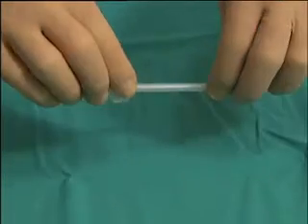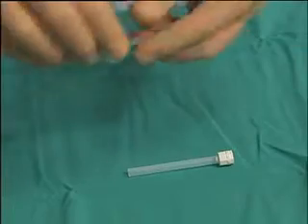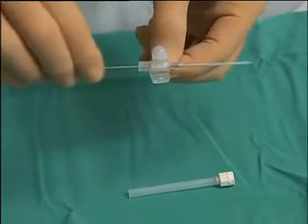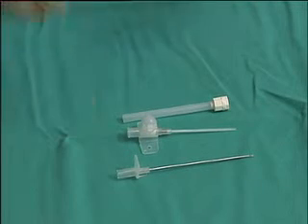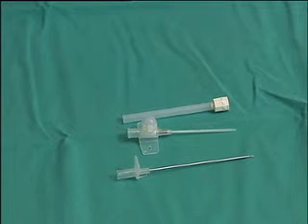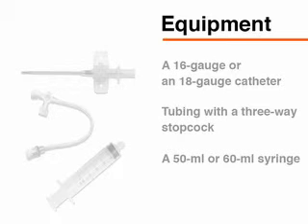Numerous devices can be used to perform needle aspiration. You should be familiar with the specific devices available at your institution. In this video, we will use an intravenous over-the-needle catheter to demonstrate the procedure. Begin by gathering the necessary equipment.